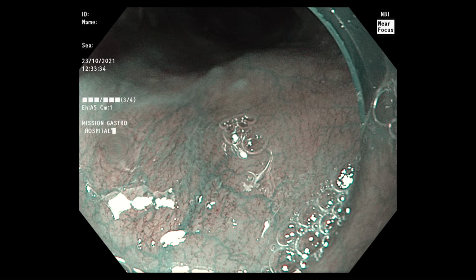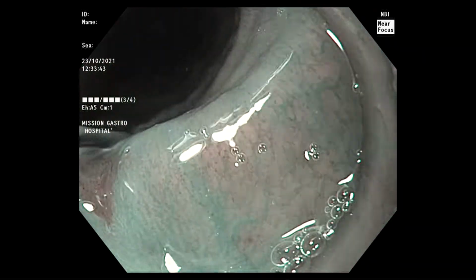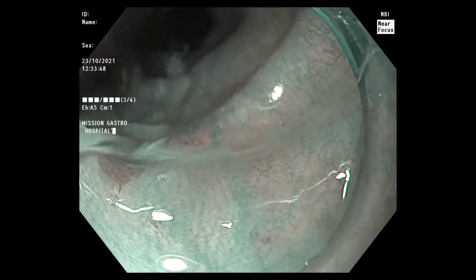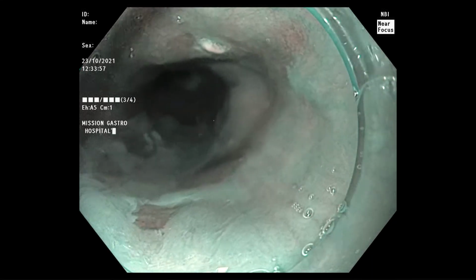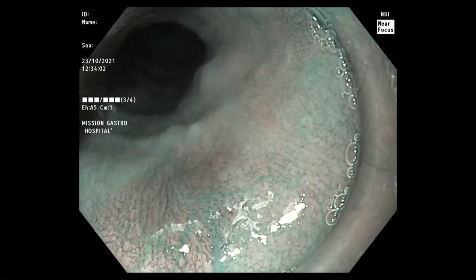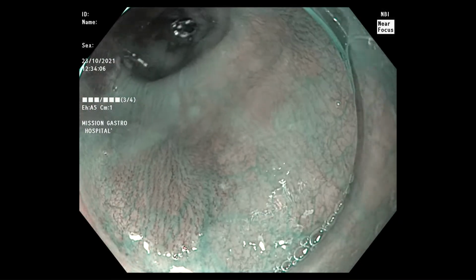Why don't you wash that a little and get a little more sort of in focus? See, the interesting thing is got a nice brown area. So focal lesion here. There are, I think, 2 different kinds. There's a lot of muck over. See, once you have an area formation, then you're worried.